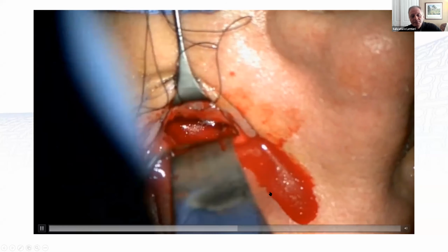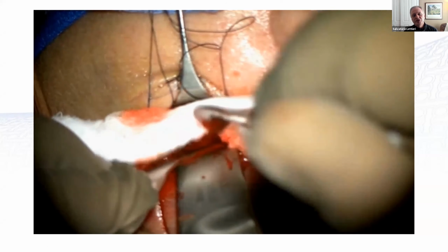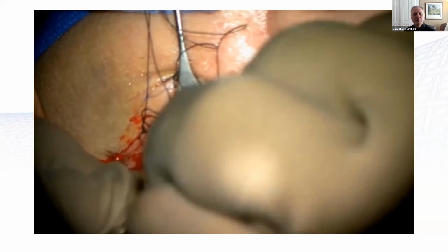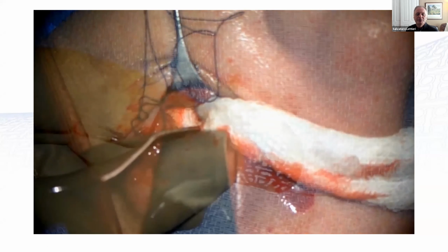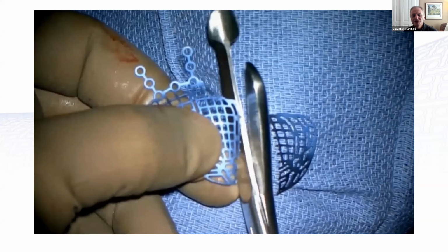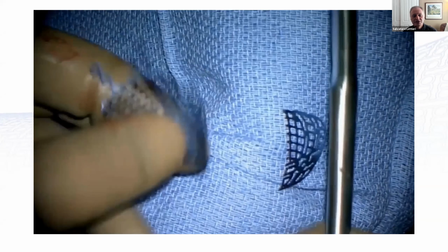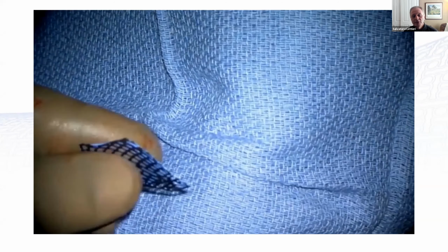And then now, usually you can measure, it's usually like 23, 24, 25. Some people think 33 millimeters, but you can use your retractor and then gauge where you want to go. As far as the length, with this one, we're cutting off the medial wing. And there's a couple of little pearls here. I tend not to use the little foot plate tabs for an isolated orbital floor. This is an anatomic plate. There are different commercial brands available. I'm not promoting any one of them.